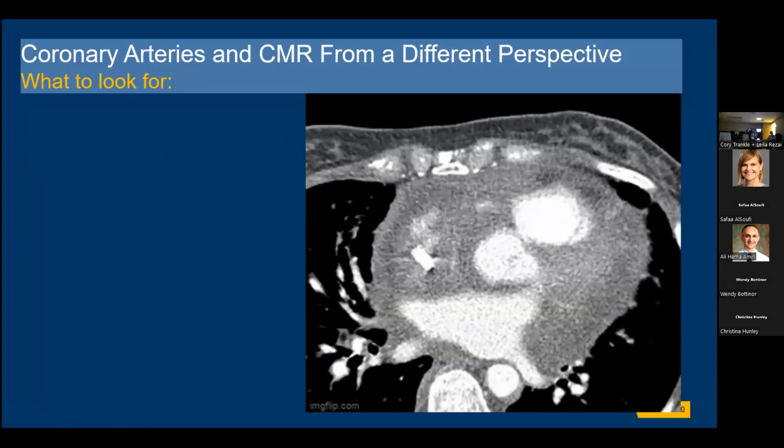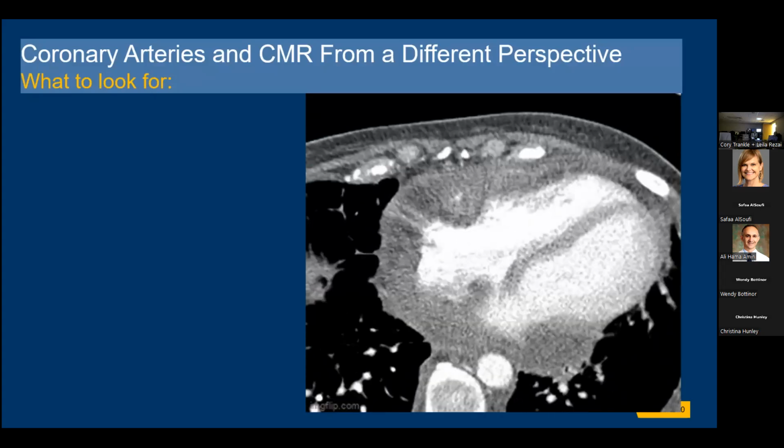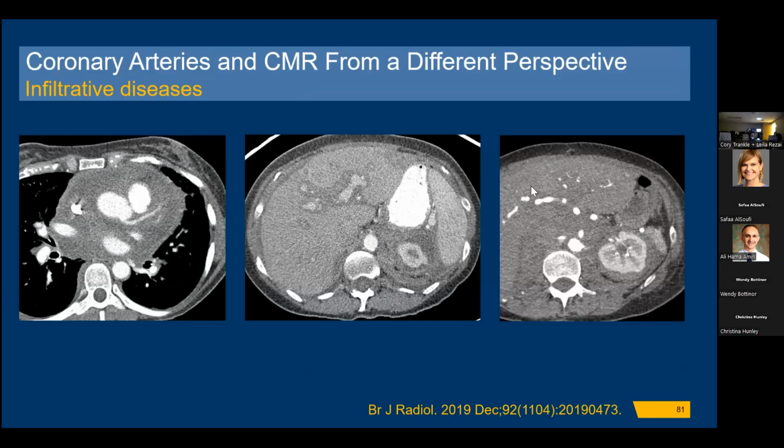We can also imagine that the pericardium is all thickened. This also encases the coronary arteries. However, the coronary arteries appear to be patent, at least to some extent.